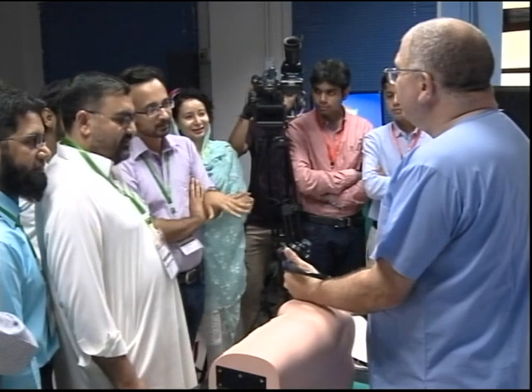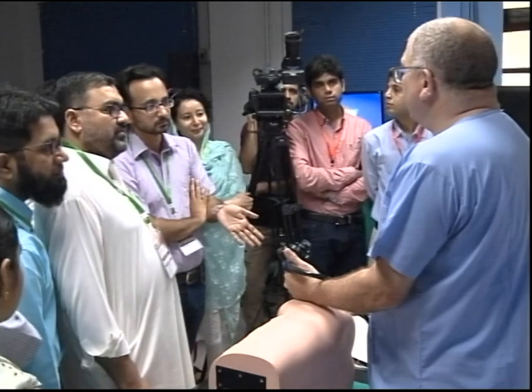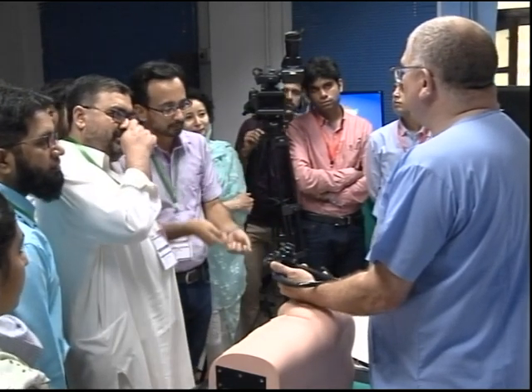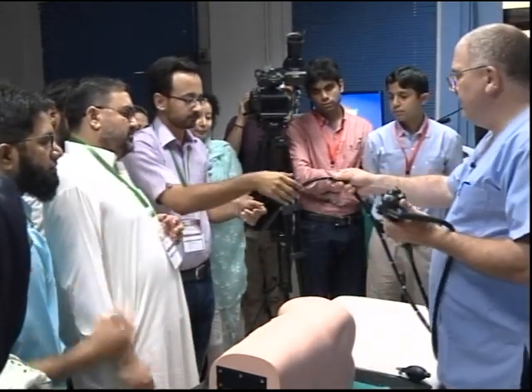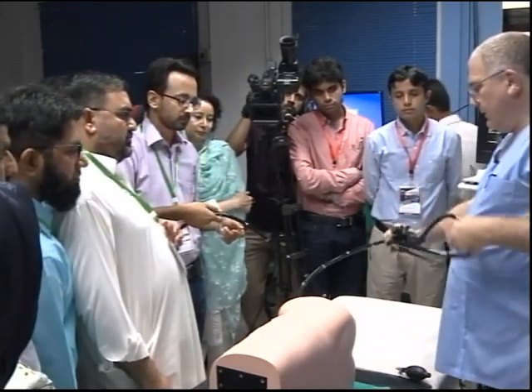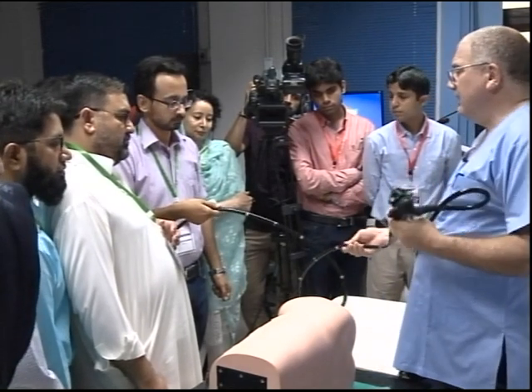Is this the only way we can de-loop a loop? In what way? Well, how else would you want to manage it? You're reducing the loop. Take out the loop. Hold the scope just there. So we've got a loop in the scope. If I've got a loop in the scope, is that the only way? What I can do is I can apply the torque.